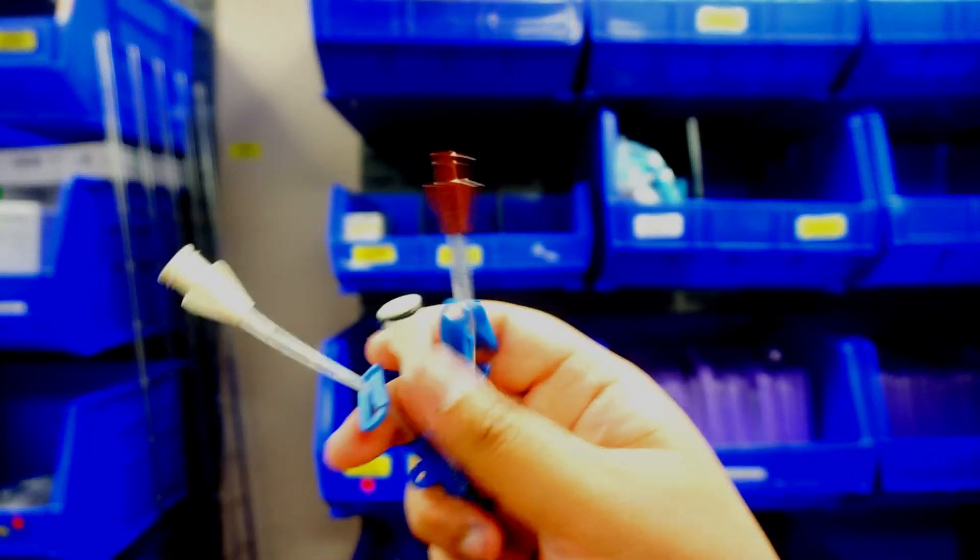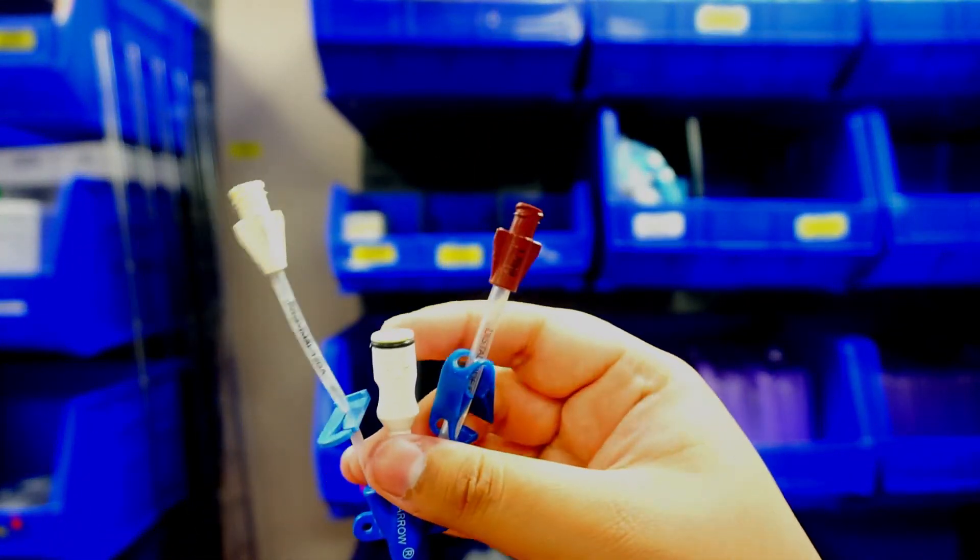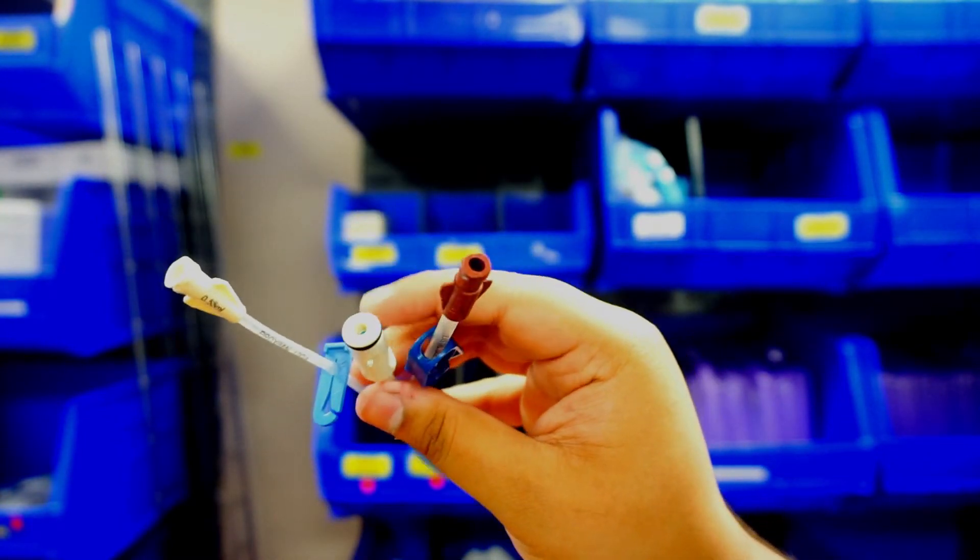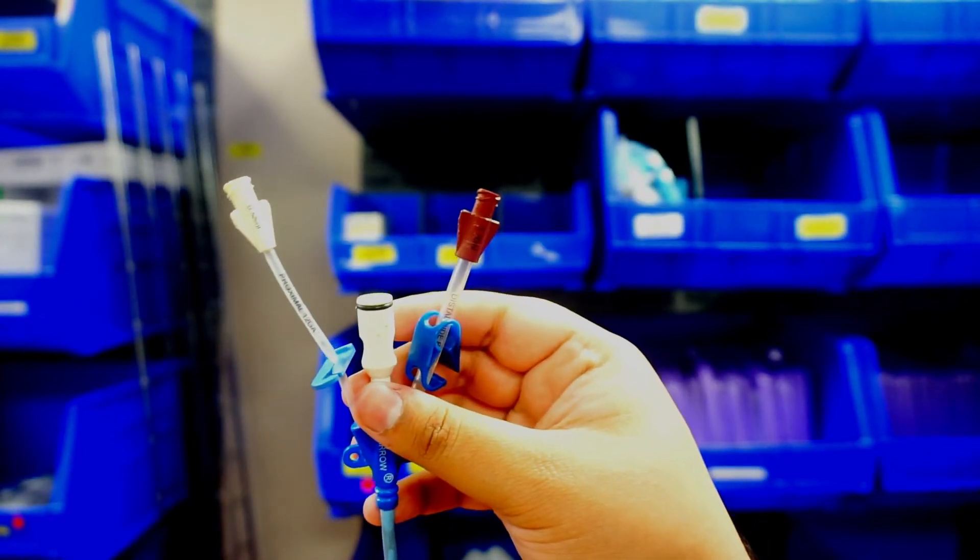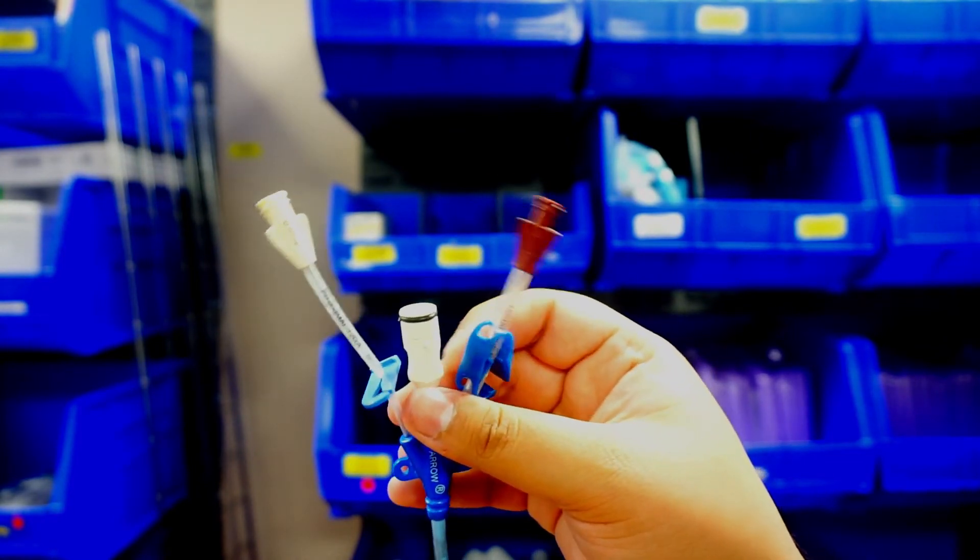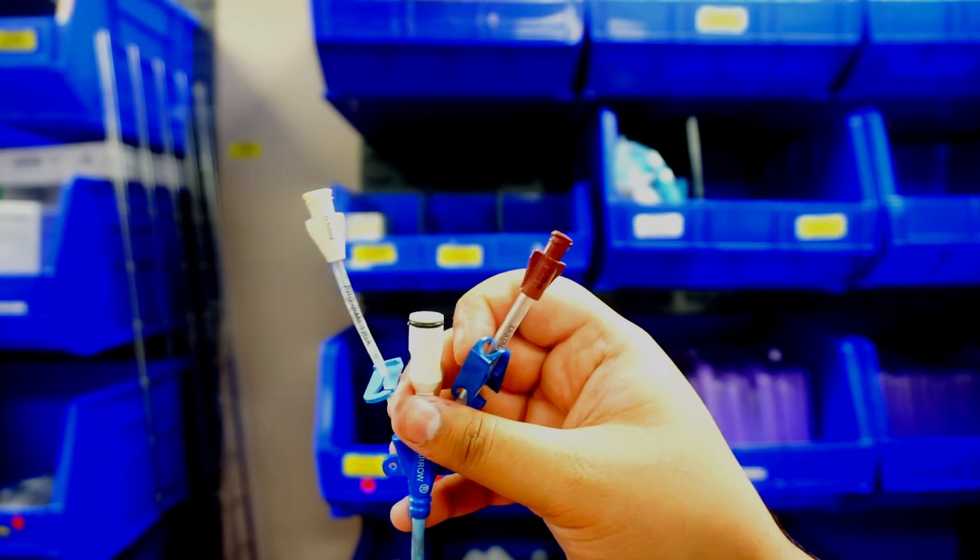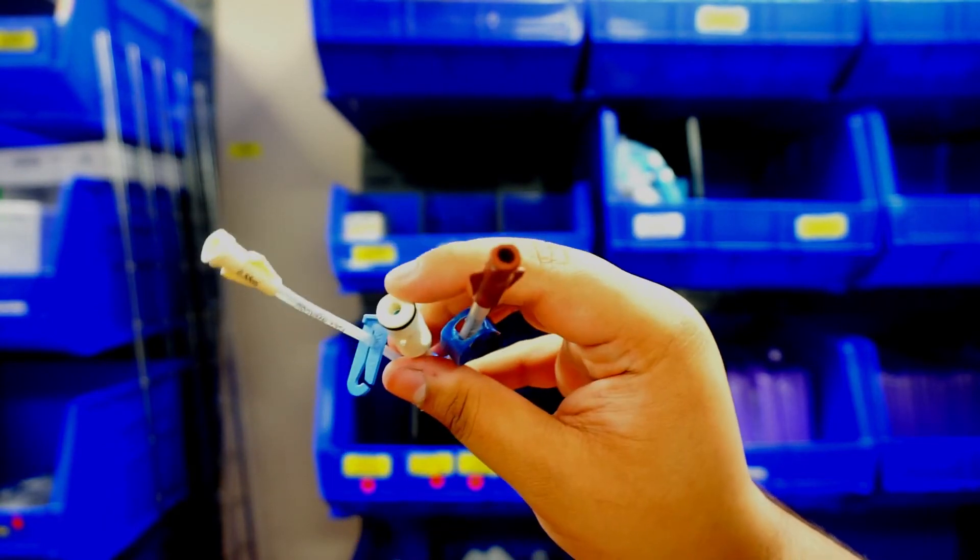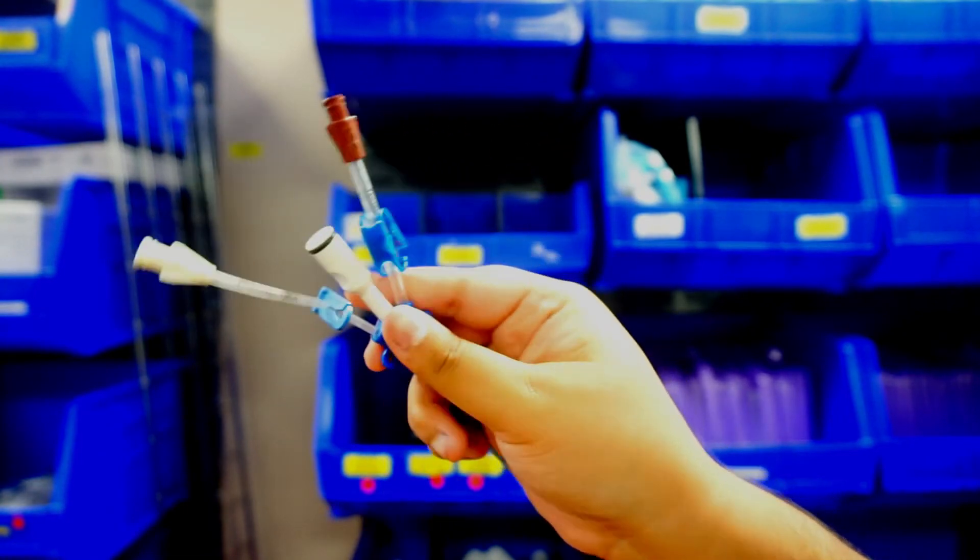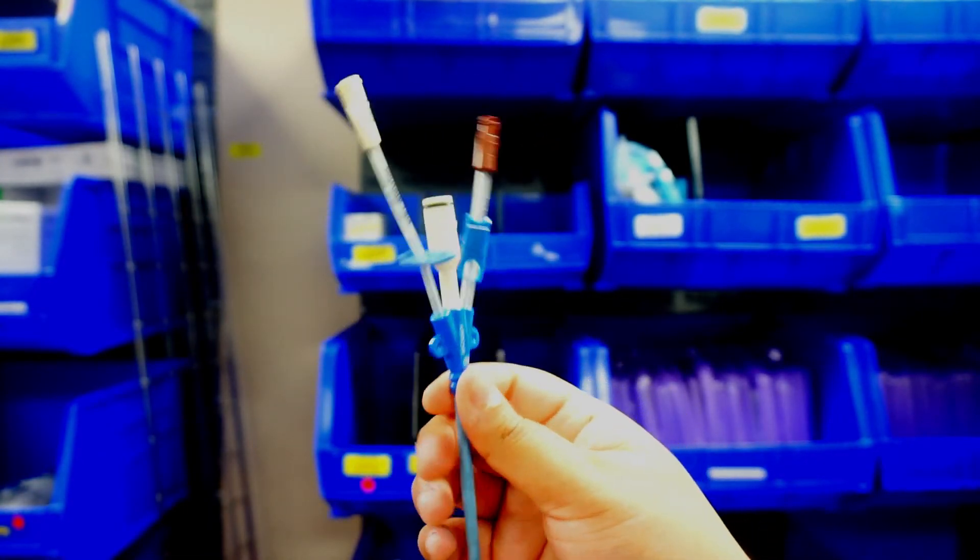And this end here, you're going to go ahead and redress it if you have to put a Tegaderm over this end. There are caps that come in the Cordis setup, but we do not have those caps. So put a Tegaderm over and that's going to keep any air from going in through this hole into your line. And that's pretty much it. Then you're just going to have your Cordis in place.